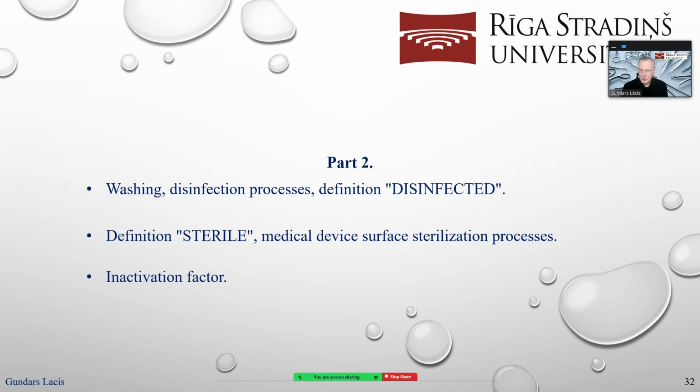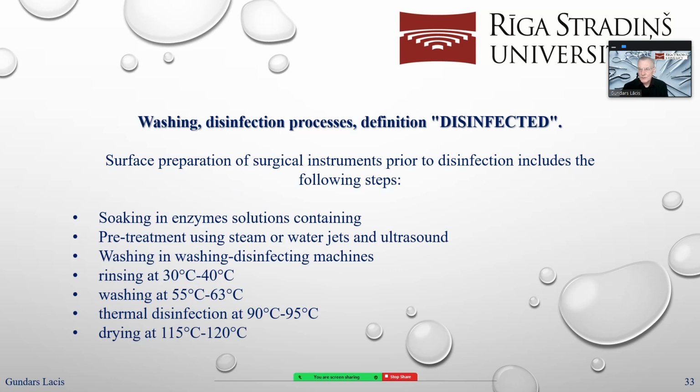Washing, disinfection processes, definition disinfected, definition sterile, medical device surface sterilization processes, and inactivation factor. Definition disinfected, washing and disinfection processes. Preparation for surgical instrument surfaces before disinfection processes includes the following steps.